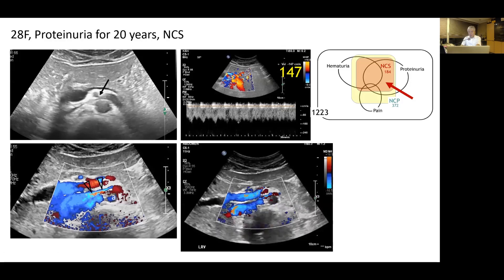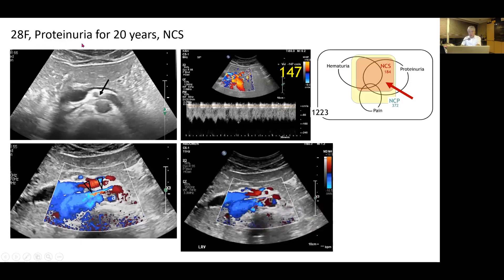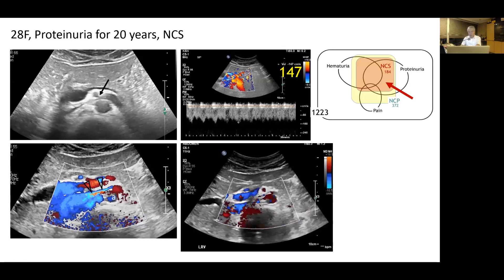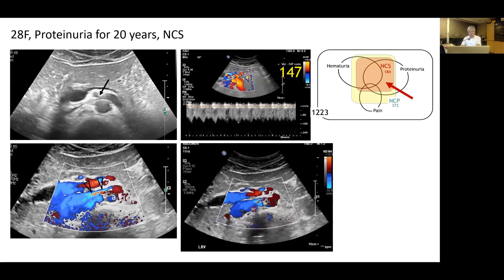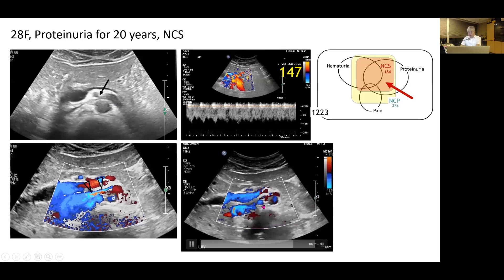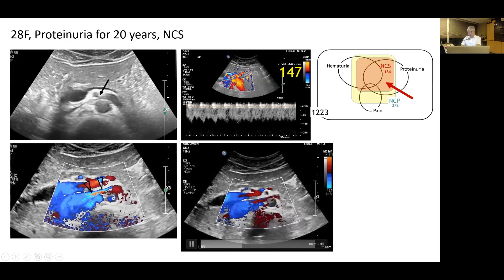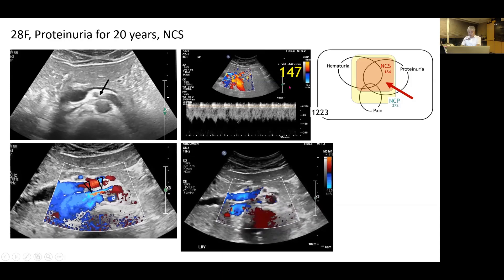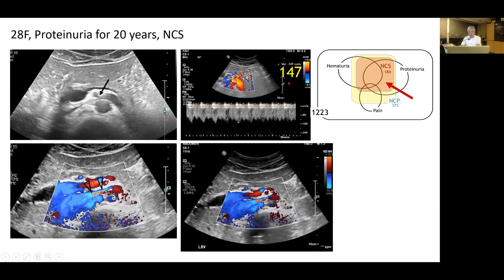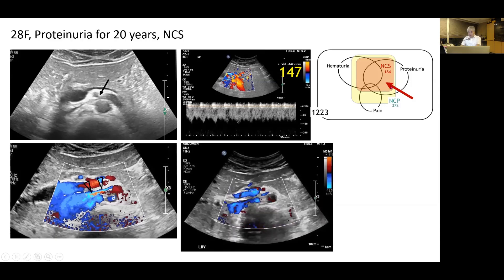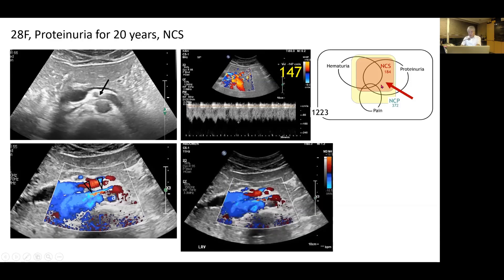A 28-year-old woman found to have proteinuria for 20 years — since childhood, she was told her kidney may have problems of unknown cause. She visited my clinic; grayscale ultrasound shows narrowing of the aorto-mesenteric left renal vein, and color Doppler ultrasound shows jetting of bright colored flow from the narrowed segment with a peak flow velocity of 147 cm/s. She was diagnosed with Nutcracker syndrome with proteinuria.